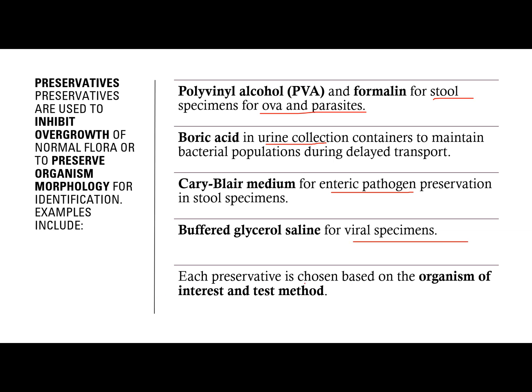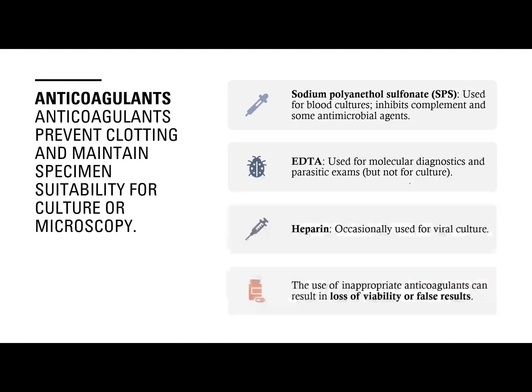Each preservative is chosen based on the organism of interest and test method. So take note of the different preservatives, class. Then let's talk about the anticoagulants. They would also maintain suitability of the sample.